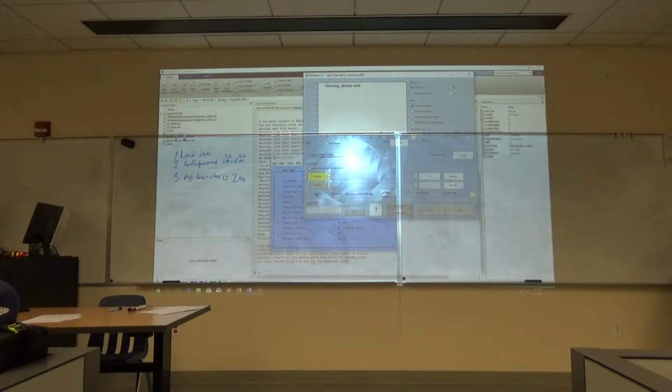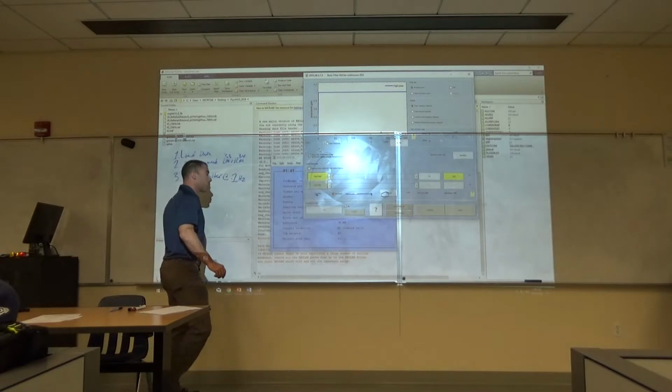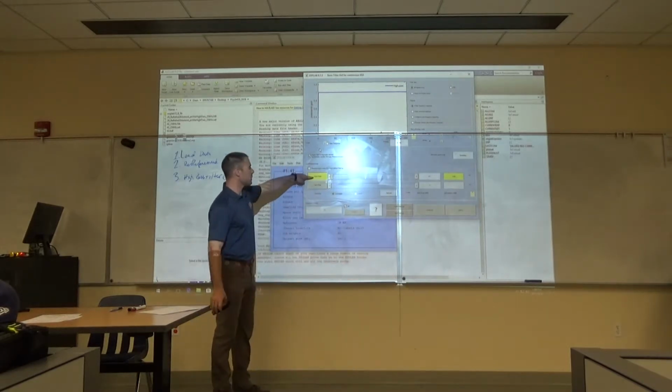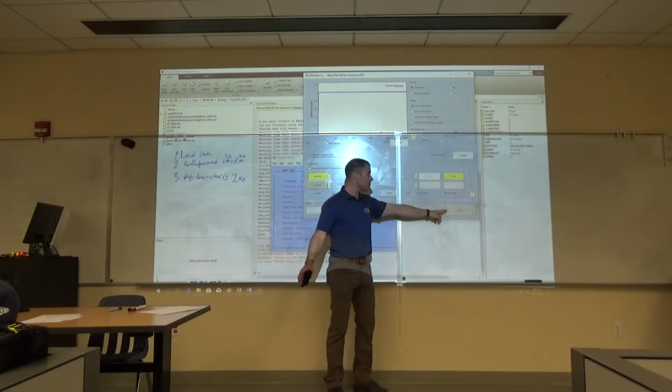So when I click that, it brings up this other GUI. And it's basically already done for you. There's really nothing that you have to do. It's really simple. Okay? Our high pass setting is already checked. That's why it's yellow. That's already set at 0.1 hertz. So all you have to do with your pretty little hand is click this pretty little button.